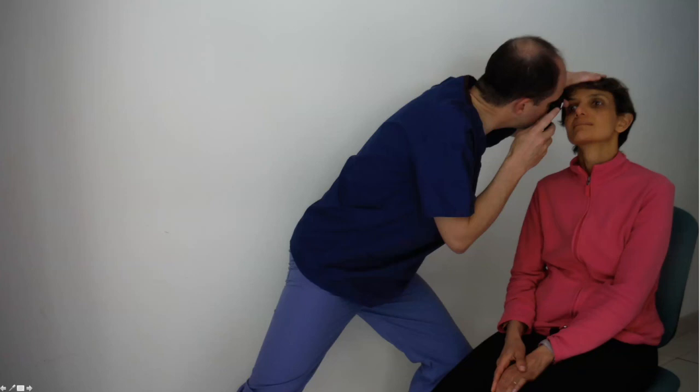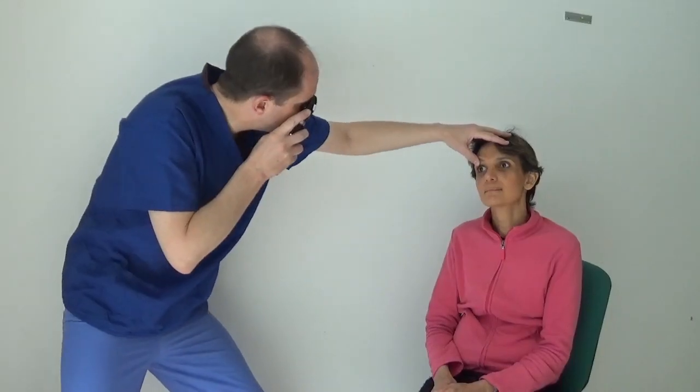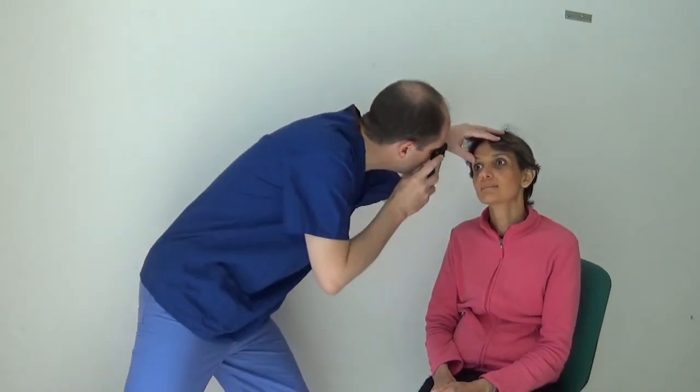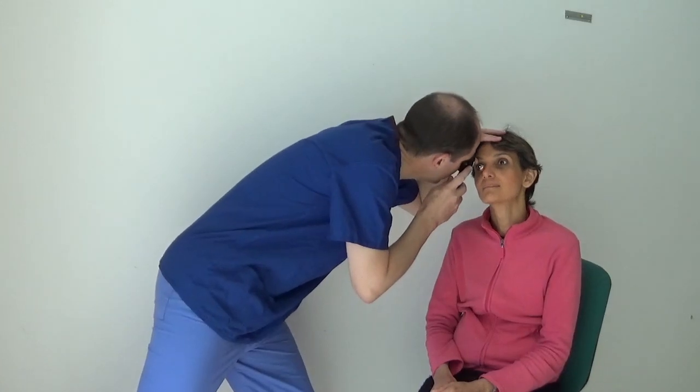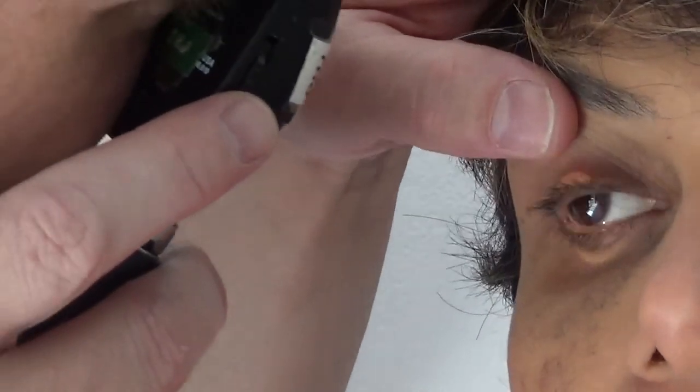The closer you are to the patient, the more of the retina you will see at once, so you need to be as close as is decent to the patient. My suggestion is that you hold your ophthalmoscope and your nose hard up against your thumb knuckle such that you are as close as possible to the patient. Here is that movement in action, coming as close to the patient as possible by touching the knuckle of your left thumb with your nose and ophthalmoscope.